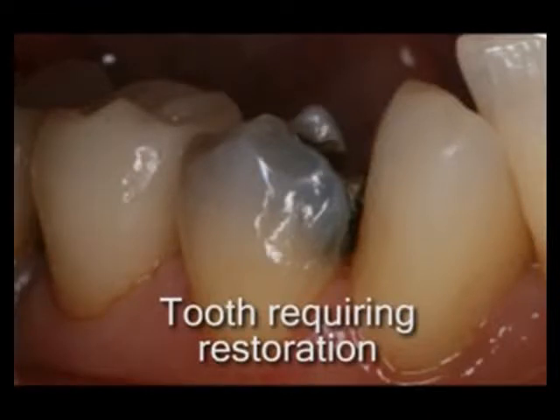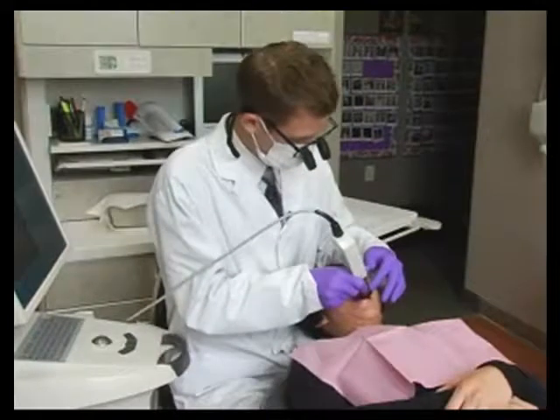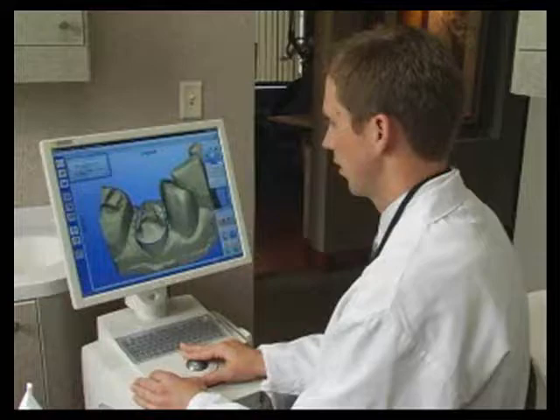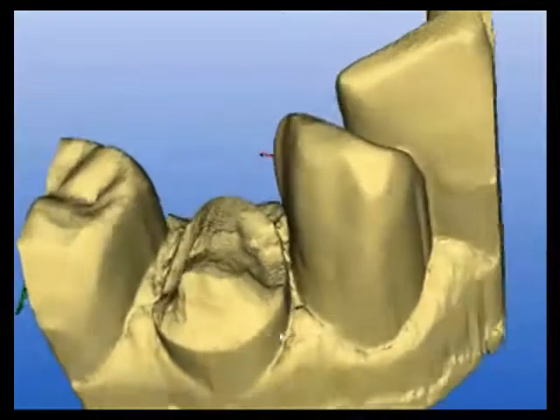After the tooth has been examined and prepared for treatment, the CEREC procedure will begin using a state-of-the-art digital 3D camera to create an optical impression. This digital image replaces the physical impression required in traditional procedures.